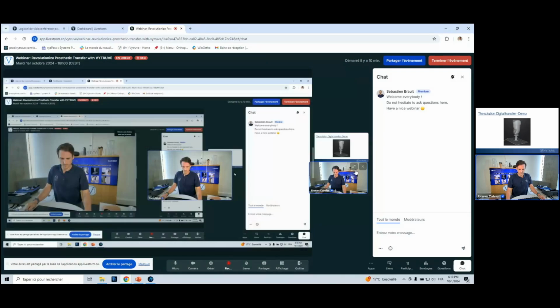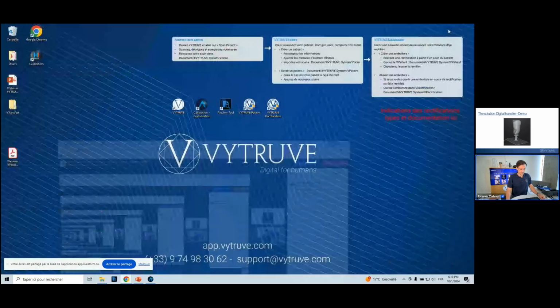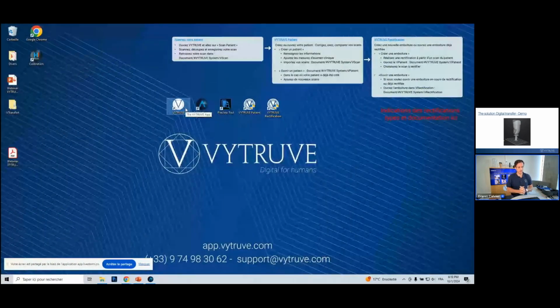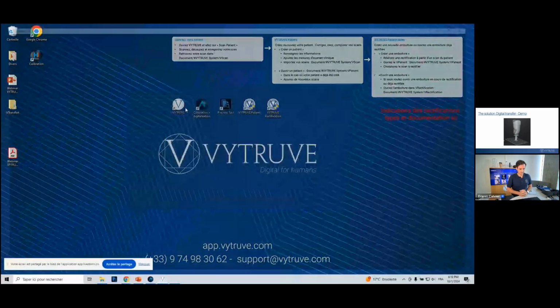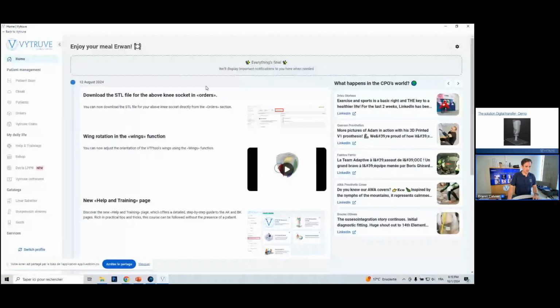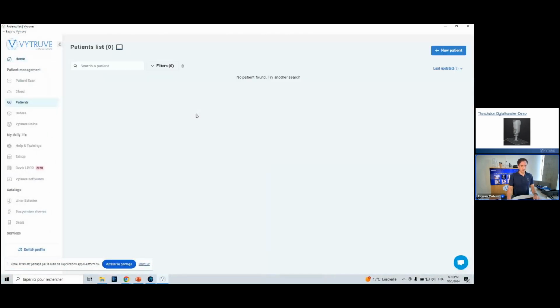I will create the patient directly in Vytruve, and we are going to follow the checklist, perform the scan, and after order everything. So I'm going to share my screen to show you this. So I will connect to Vytruve. When I'm here, I will create a patient.